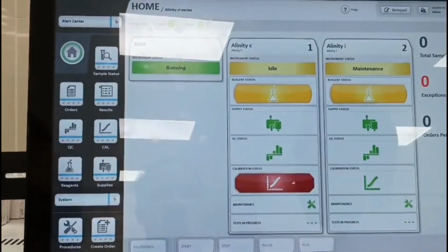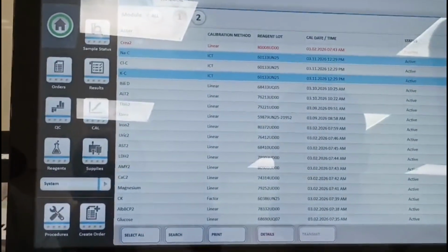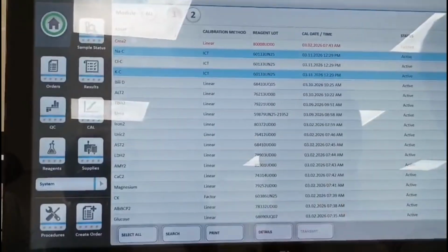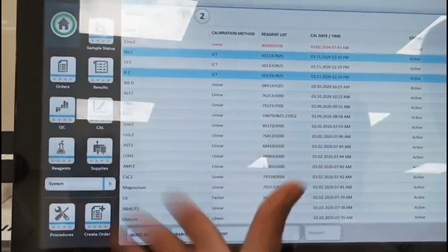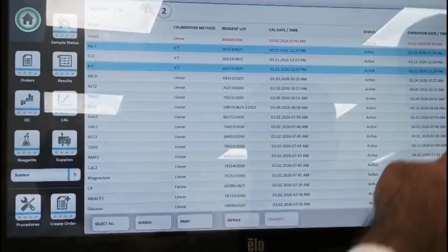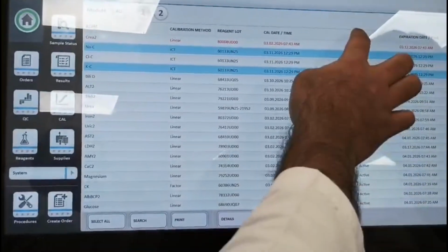One time you can do all. Now see, already finished. Electrolyte, 12:29 p.m. already done. Okay. Maybe next, it will come out automatically, the machine takes calibration. Now leave it. Don't bother this one. Another, all parameters active. Active means calibration done. Anyone expert can do calibration.